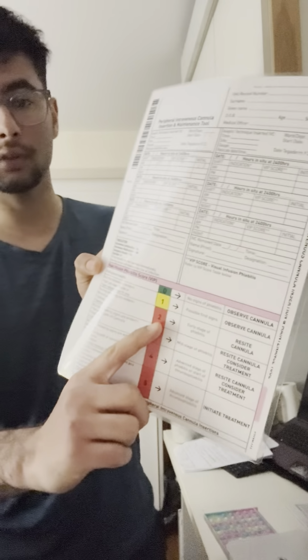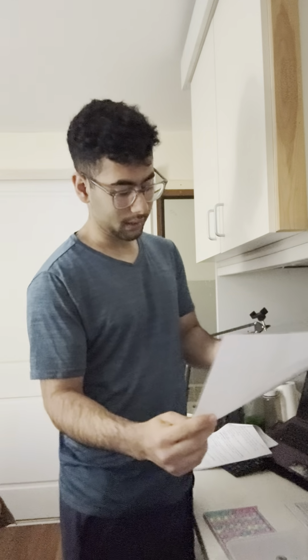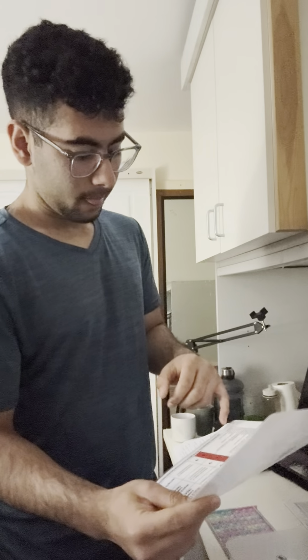But if it goes from 2 to 5, you can see the red zone, that's a danger zone. We are not administering the medication; we have to resite the whole cannula, which is totally fair because we don't want to take the risk. There might be something wrong, there might be edema, erythema, pain along the cannula, and a lot of issues that come along the way. So we're going to check the VIP score before administering.